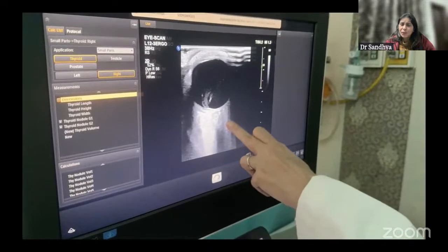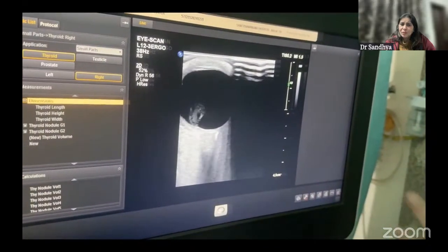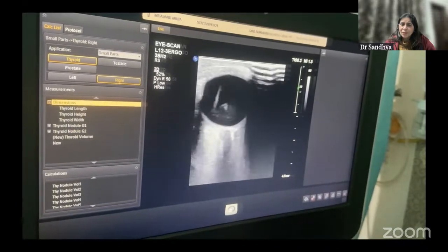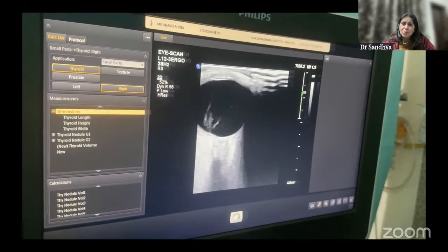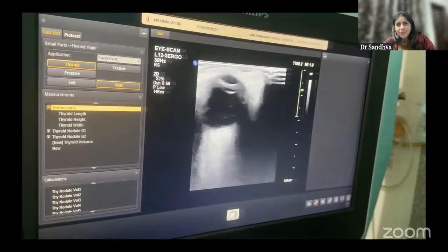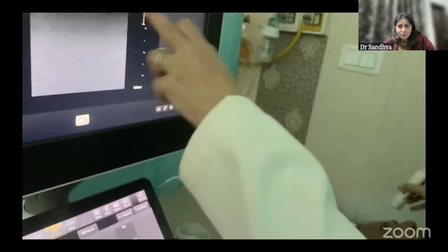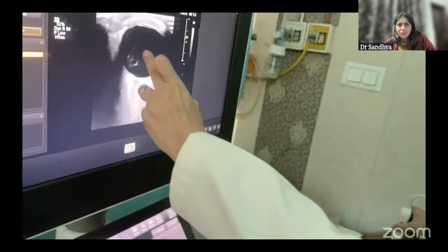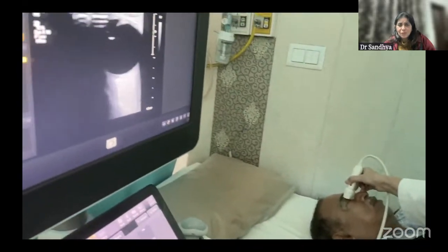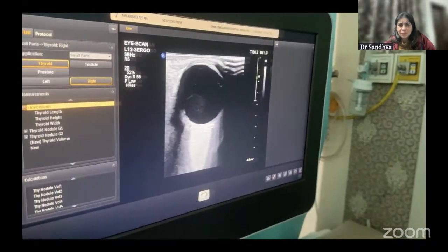This is the posterior scleral shadow and optic nerve shadow. And then we look for any membranes or echogenicity in the globe. The moment we start seeing any pathology, we stop there and work around the pathology in different sections. Now, in this case, we were seeing those shadows on one side, so now we start orienting our probe horizontally and medially to see where these membranes are seen.